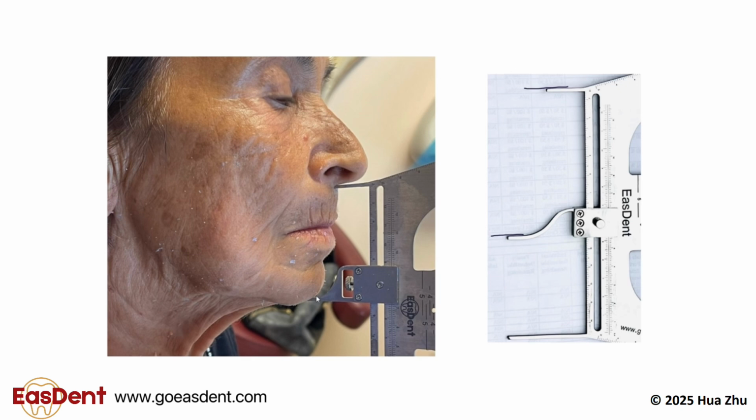The width of the movable stick is 2 mm. Therefore, the bite position is 2 mm less than the preset VDO. This 2 mm room is left for the thickness of the final impression material. If your final impression material is thick, it will raise the VDO a little bit. Thick final impressions happen a lot, especially for beginners. Your final impression thickness may not raise the VDO by exactly 2 mm. You can measure what VDO you get after your final impression and let the lab increase or decrease the VDO to what you want.